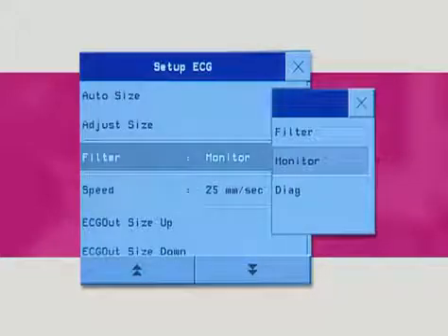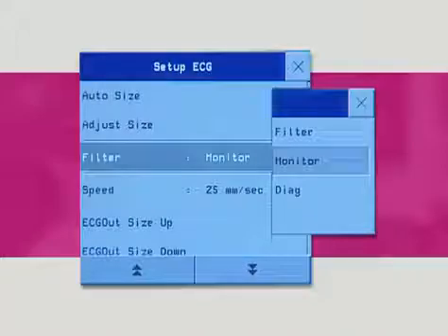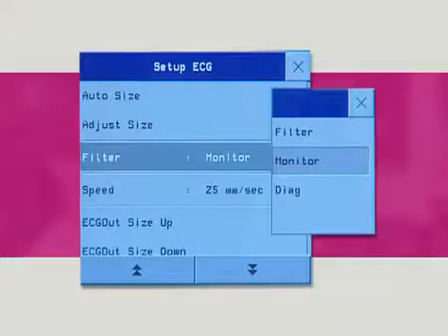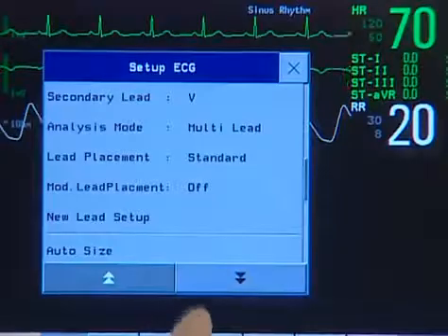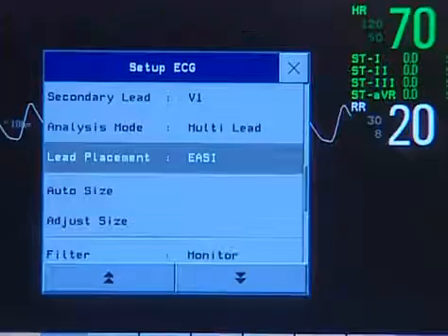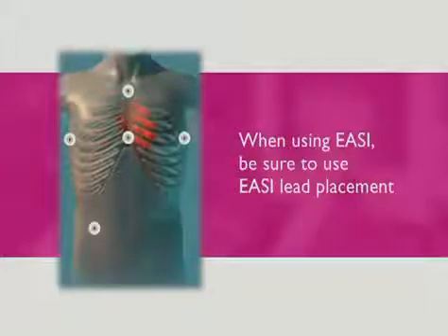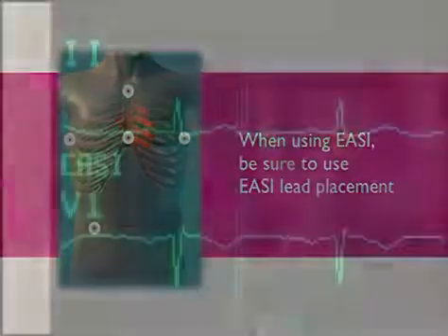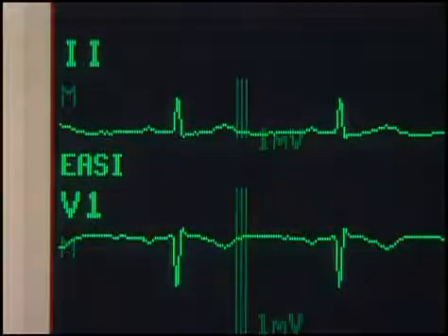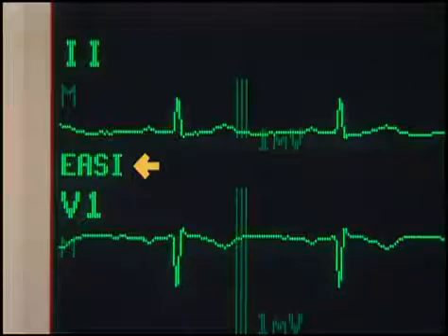In most ICU environments, the default is monitor, which minimizes movement artifact. Diagnostic is used when a clinician wants to view a virtually unfiltered ECG. If you want to use the easy 12-lead placement, you must enable it in the ECG setup menu. When using easy, be sure to use the easy lead placement. When easy 12-lead is enabled, this label is shown beside the 1 millivolt calibration bar on the ECG wave, and easy is marked on any recorder strips and printouts.